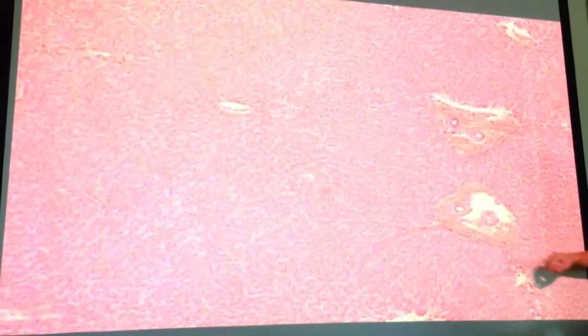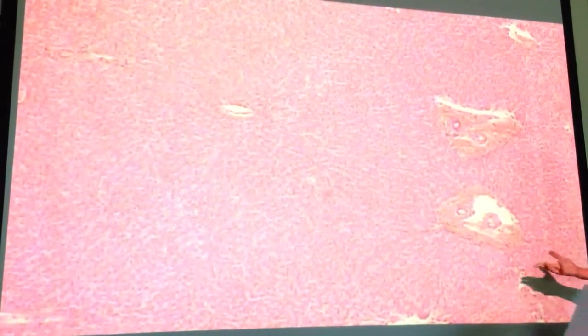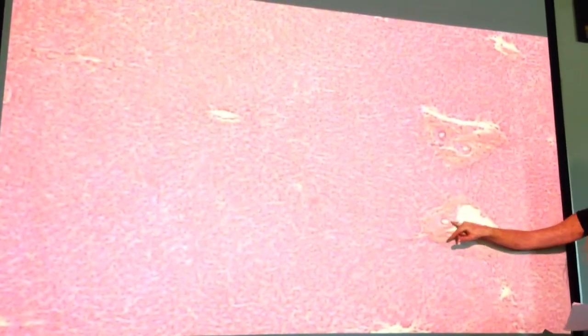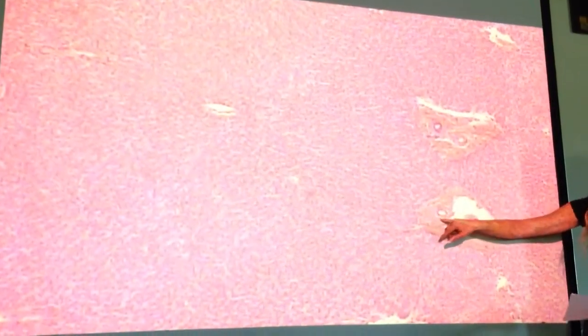So if we come over here, we can identify what these things are. If we look at this one specifically, it's not as clear as I would like it to be, unfortunately, but this is going to be our bile duct. You can tell because there's that dark ring of nuclei that will belong to the cuboidal epithelium, so that's how you know it's a bile duct.